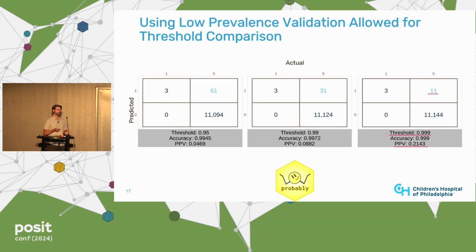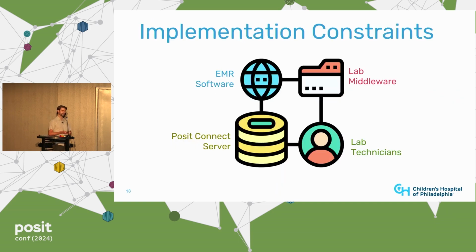So there's a trade-off there. And this sort of analysis across these thresholds can at least help inform that discussion on that exact trade-off of what we estimate the false positive rate to be and the benefit of potentially catching these WBIT errors. Again, this is for the future as we think about implementation.